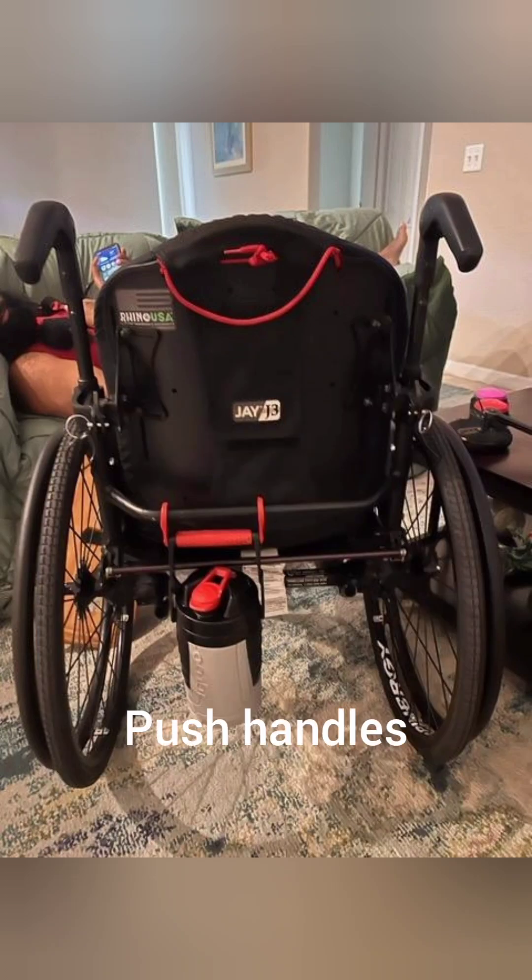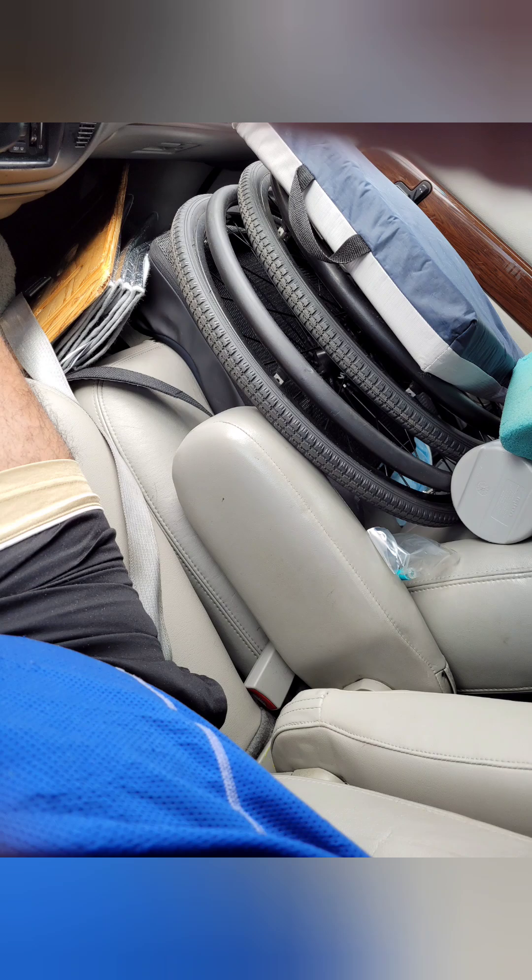I don't like how the push bars stick up like that. I'd like to get them bent inward so that when my arms come back when I'm pushing or exercising, my elbow doesn't contact that. I would take them off, but sometimes it's nice to have them there in case I need to push. Here's a little bonus — I used to take my chair apart and throw it in the back seat, but that's kind of tough on the shoulder. Since then I met another wheelie brother and saw how he does it and throws it in the passenger seat. Now my frame sits in the passenger seat and the wheels and cushion get thrown in the back.